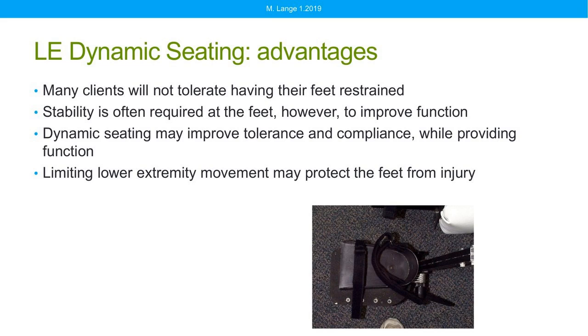There are a lot of clients that use wheelchair seating that will not tolerate having their feet restrained. It's very common for us to strap down people's feet for all sorts of reasons. It might be to protect the feet or to provide stability for the client. Sometimes by allowing movement at the knees or the lower extremity in general, we might find that a client will tolerate having their feet strapped to that foot plate better.